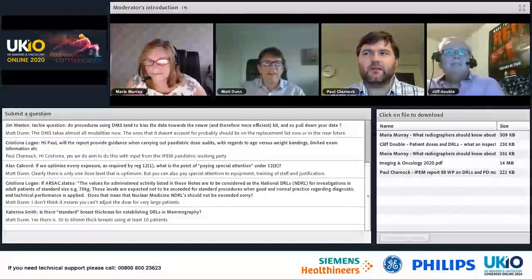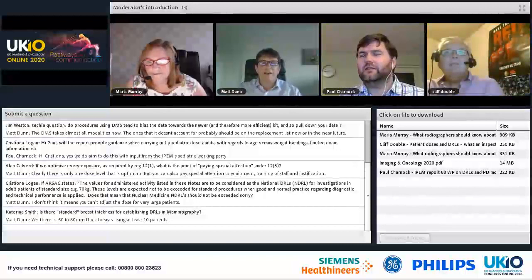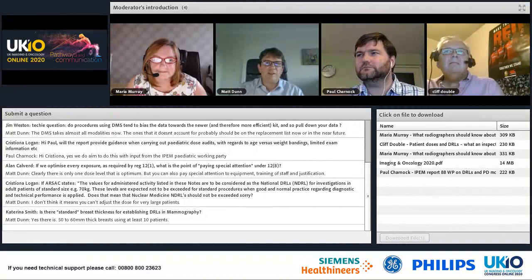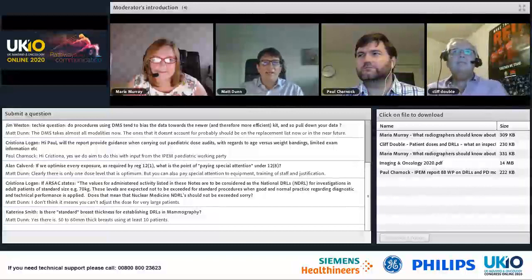Yeah, I think they're doing different things, really, aren't they? I think the purpose of the national DRL is really to say, well, we look at the range of systems, as you said, and to highlight where we think that the practice shifts from good practice to practice that needs to be perhaps looked at or optimized. And I think it's a fairly blunt tool, really.